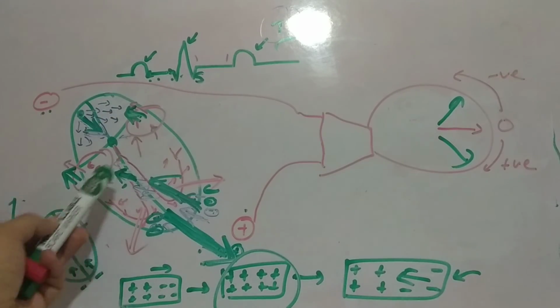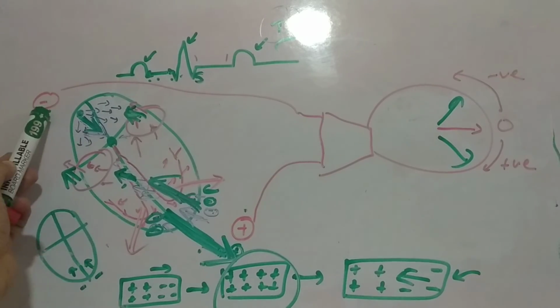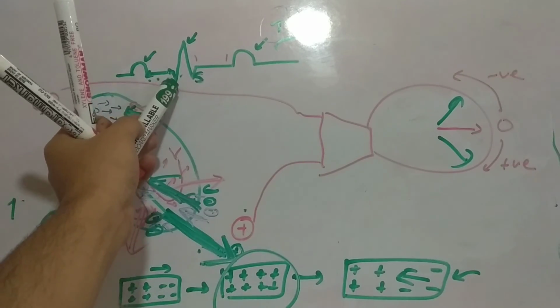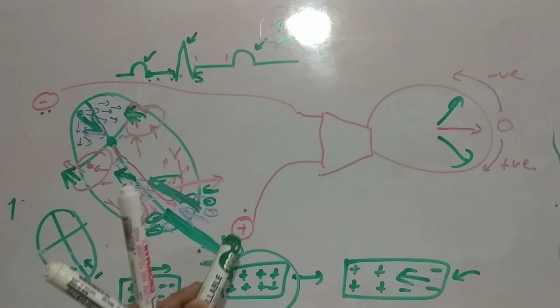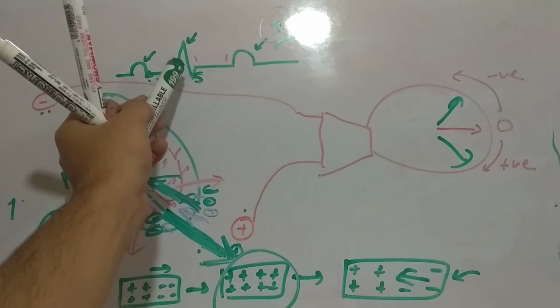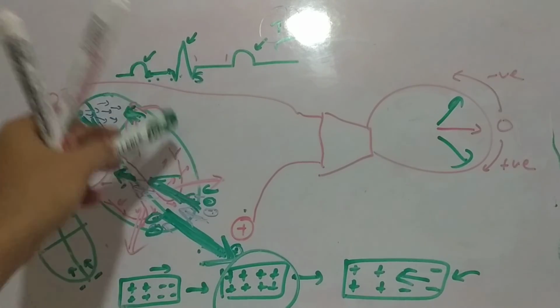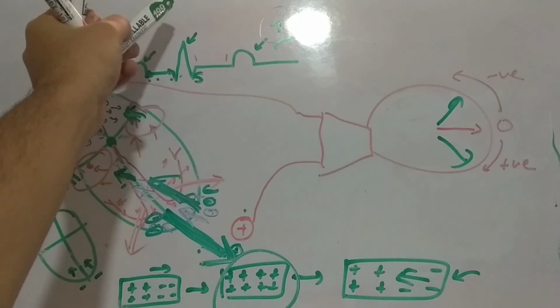Q is nothing but the septal depolarization, and here you can see the positive vector moving towards the negative electrode, so the deflection is negative. The resultant vector of ventricular depolarization is moving towards the positive electrode, a positive vector moving towards the positive electrode, so the R wave is also positive, and because the magnitude of the ventricular mass is higher, the magnitude of the R wave also increases.